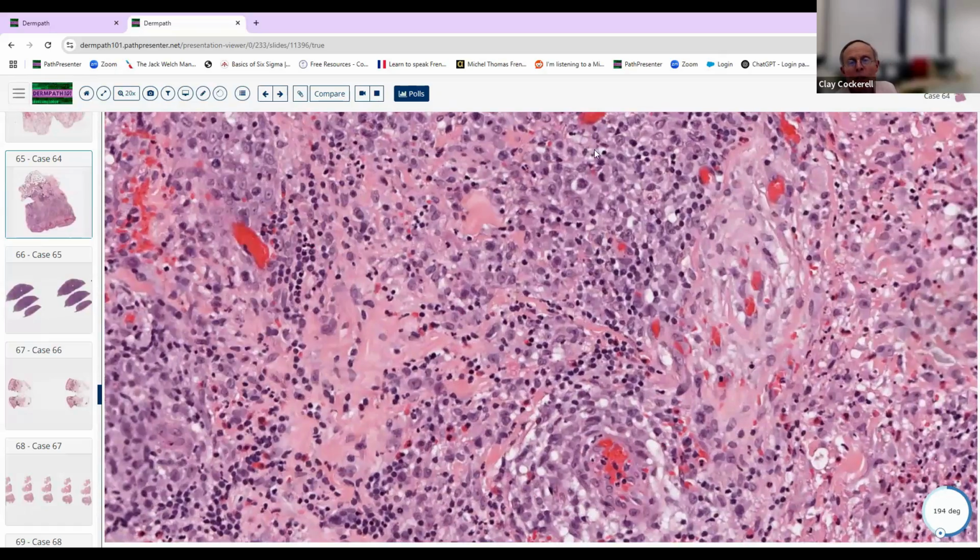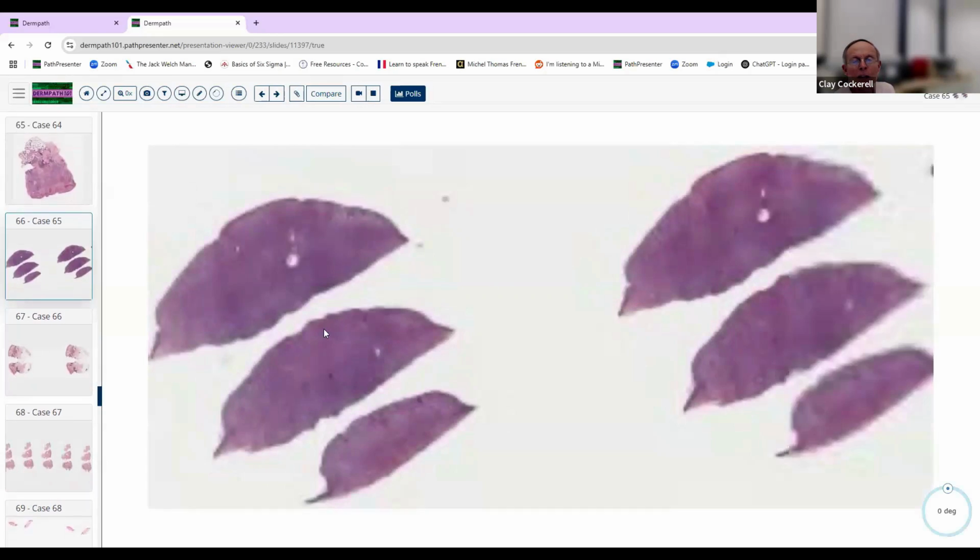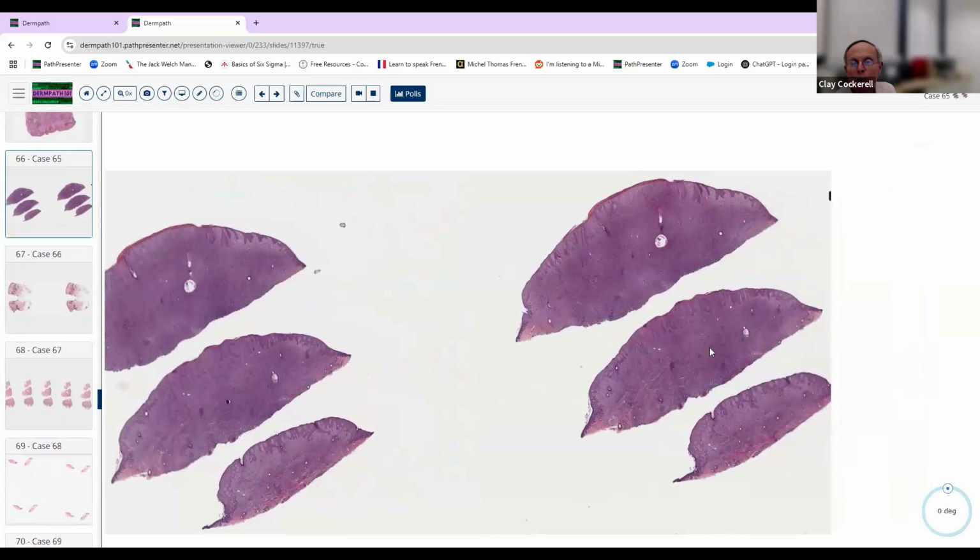And it does show the features: the nodular infiltrate, dense diffuse infiltrate, sometimes wedge-shaped, the eosinophils, sometimes involves the epidermis and gives an epidermal necrosis with an eschar at the top. So you'll see that on occasion, but at least here, it's a nice example where the choices allowed you to make the diagnosis.